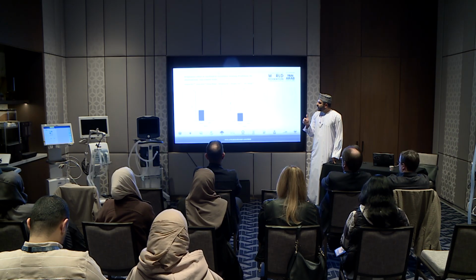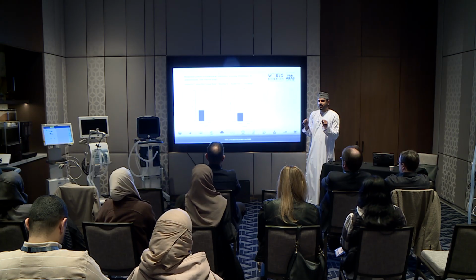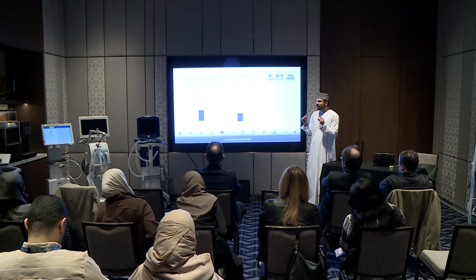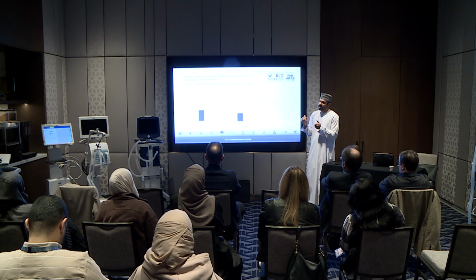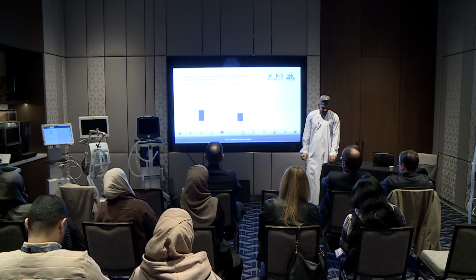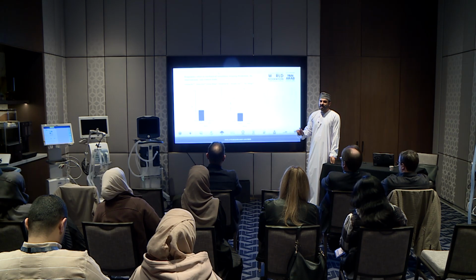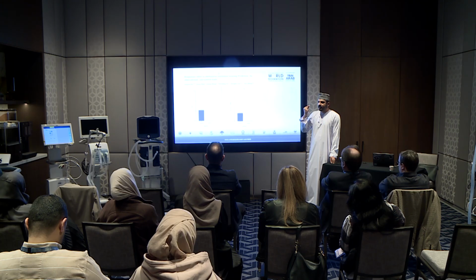This was compared to the occlusion pressure if your diaphragm thickness is intact, if there are no features of atrophy. And if the diaphragmatic thickness is intact, the correlation is much better, and it tells you that with an occlusion pressure less than 4, it's highly associated that the patient is most likely going to be weaned from mechanical ventilation. So this is the occlusion pressure at 100 milliseconds. This is more of a reflection of the neuronal input or the respiratory drive.